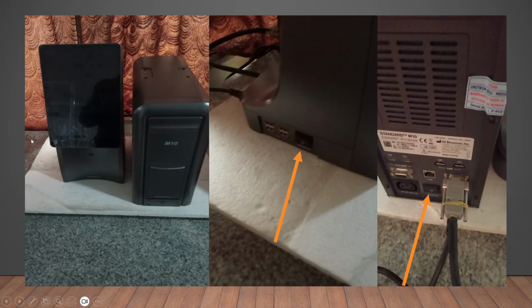So this is the instrument. This is the CPU with monitor which controls the analyzer. This is the analyzer. This is an RT-PCR based amplification test, but the only thing is here extraction and everything is inbuilt, so we call it a CB NAAT, cartridge based nucleic acid amplification test.